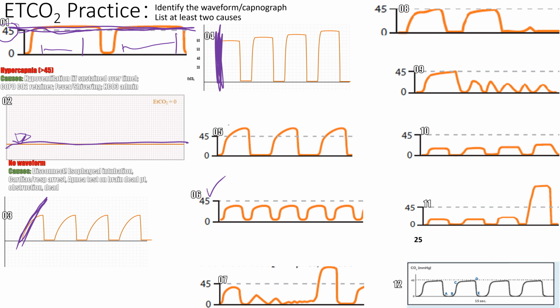Bronchospasm. Good, some kind of bronchospasm. So who gets bronchospasm? Asthmatics, COPDers very commonly, right? It could be someone with angioedema after lisinopril use. It could be something that's closing up the airway. Epiglottitis in a kid. Okay.